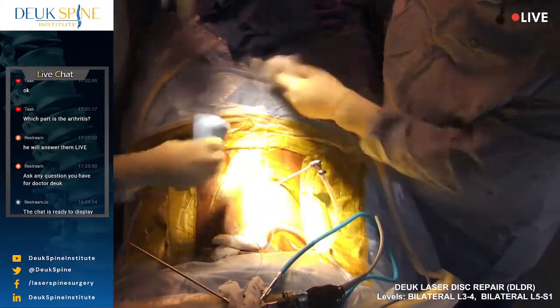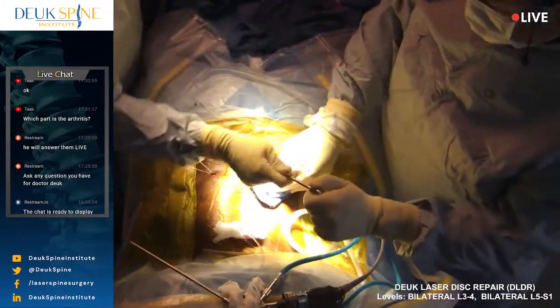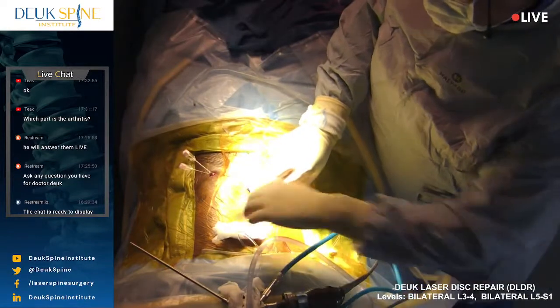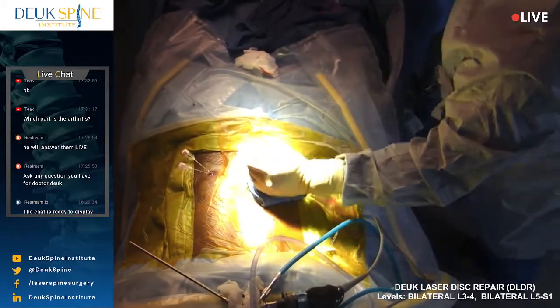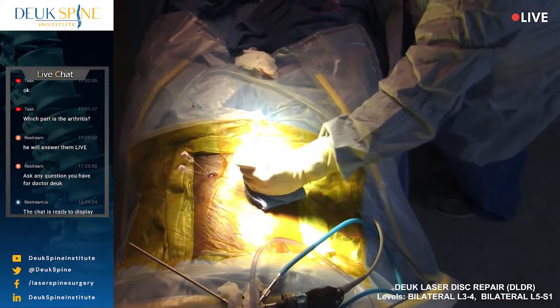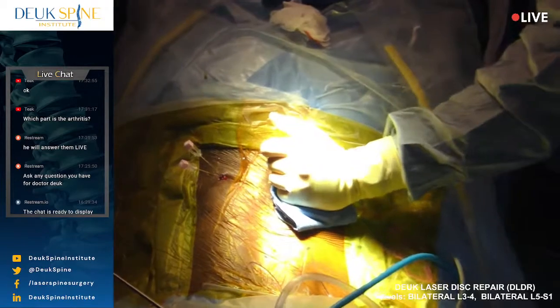Good job. We're almost done. We're done with half of the discs. We got the other half still to do. I'm going to come over to the other side. So I'm putting a little pressure on the muscle. You always want to put pressure on the muscle when you take the tube out because it could bleed a little bit. And just a little bit of pressure.